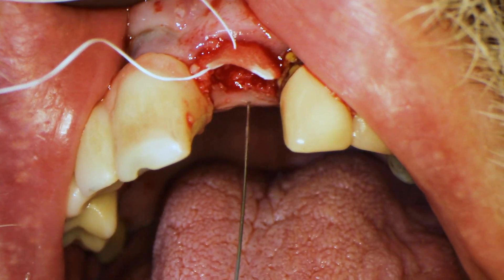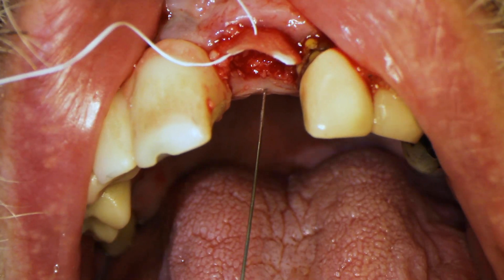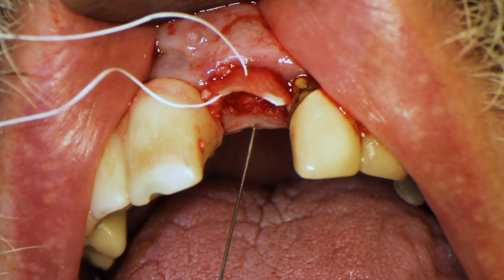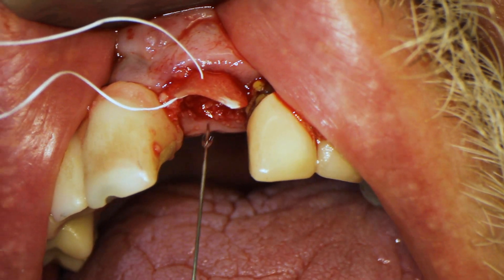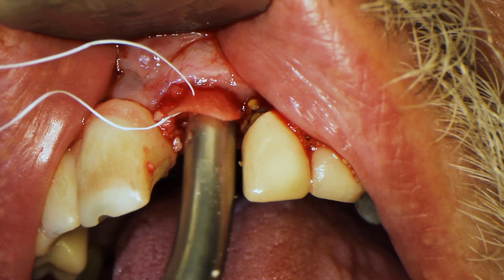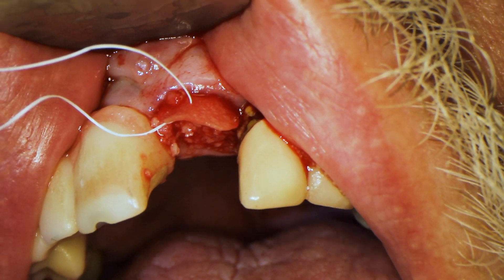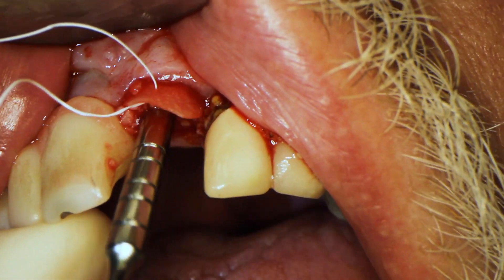Here I'm giving a little bit of extra anesthetic on the lingual gingival tissue because I'm going to be suturing there and I don't want the patient to be sensitive. Now I'm filling in a little bit of extra bone because packing created a small void — the socket is about three-fourths full — so I'm adding a little more bone and pushing it with the condenser.